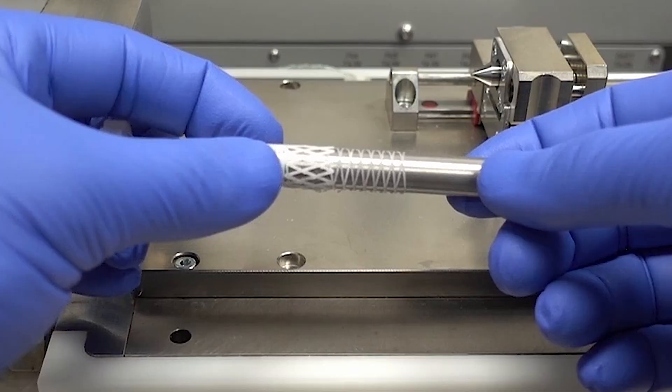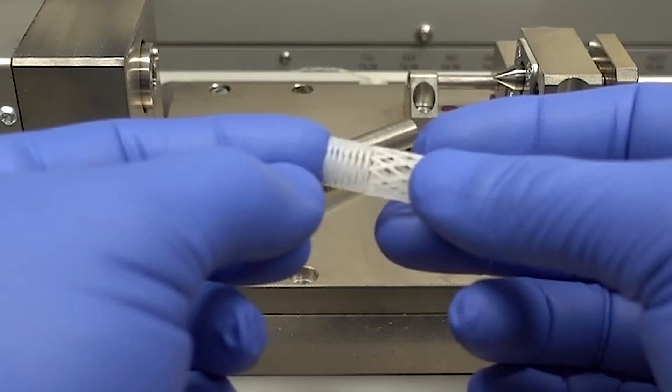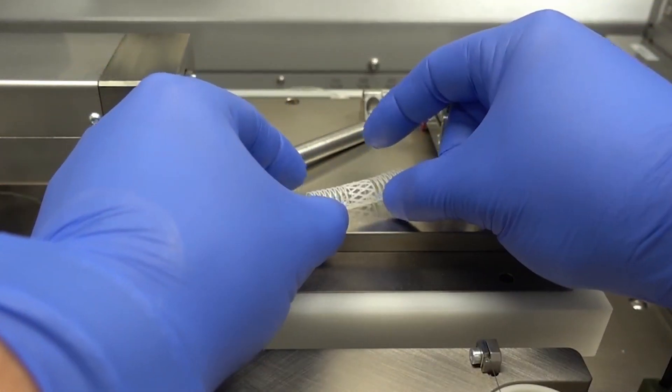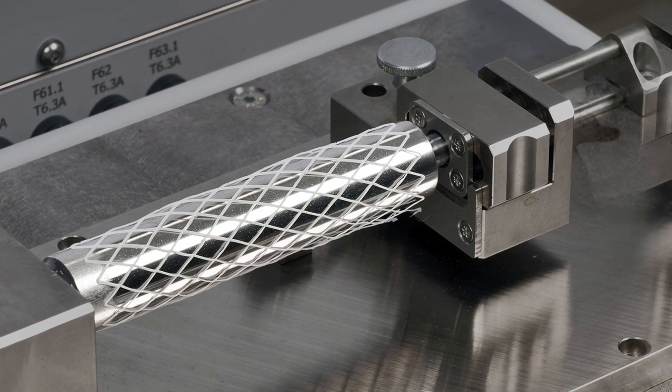The Print Roll will be available for use with 4th Generation Developer and Manufacturer Series 3D Bioplotters this year. Additionally, the Print Roll mandrels will be available in a variety of diameters for the creation of devices for both children and adults.